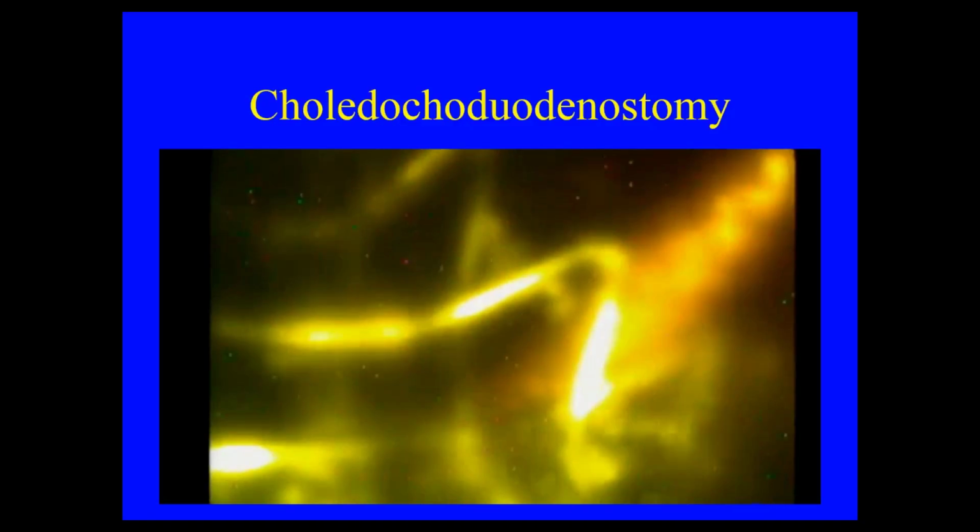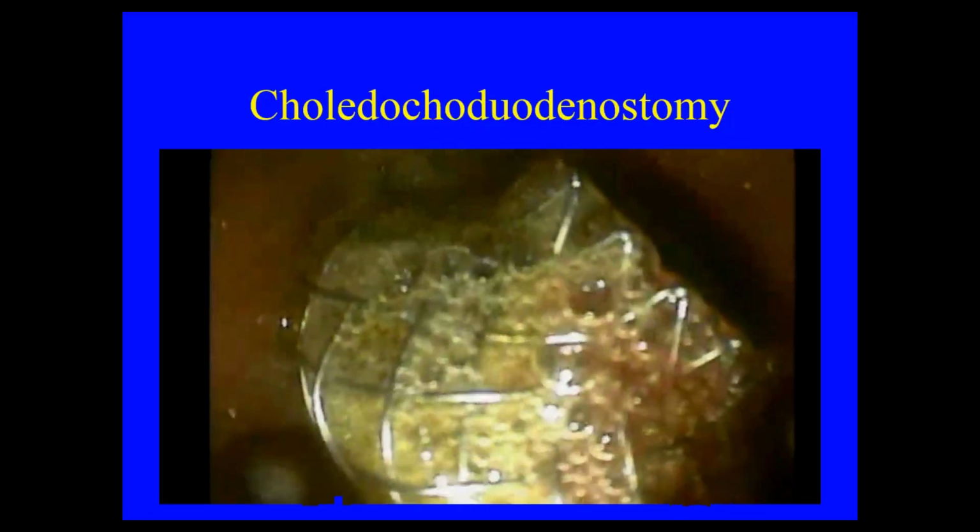Of course, with this patient, the issue was that we were not able to traverse the scope to the ampullary orifice. So after this is done, you can place a duodenal stent in the same setting. So pretty much the patient had a double bypass in less than 20 minutes. And this is for palliation. These stents are not meant to be removed.